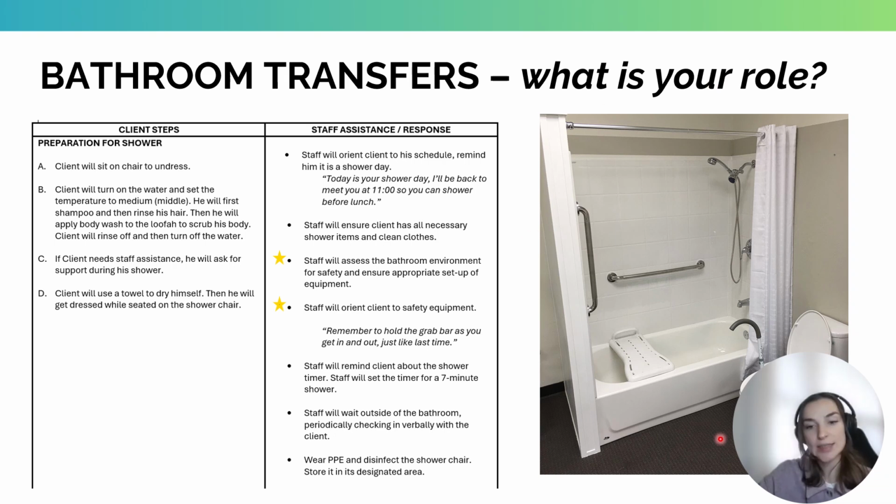So this is just an example of what a real-life bathroom setup might look like. You have grab bars here, a removable shower head, and you have a bath transfer board. It's similar to a transfer bench, just it doesn't stick out of the tub because of limited space here with the toilet. But this is a way that the client can get in and out of the tub without having to step in and out, again, for clients with those physical balance issues.